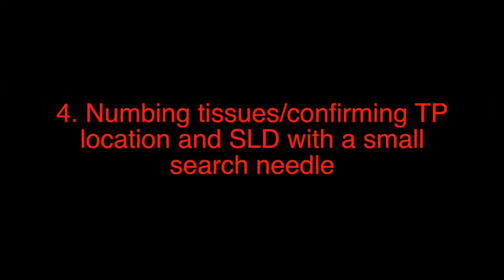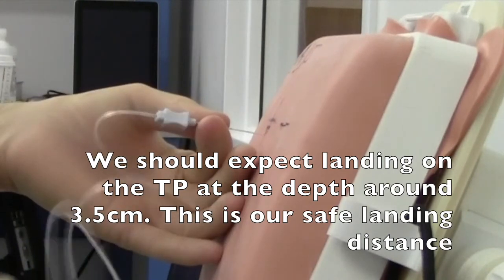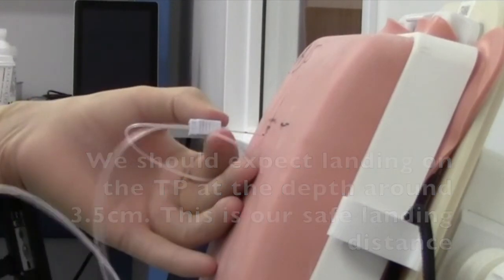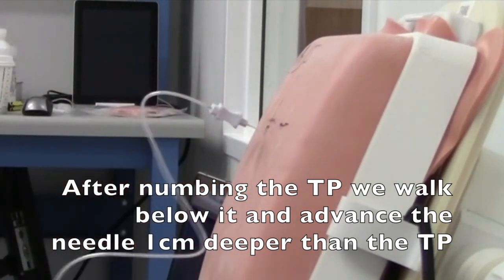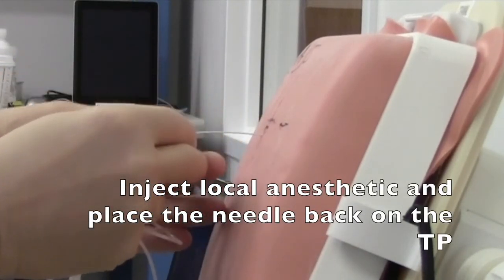Step 4: Numbing tissues and confirming TP location and SLD with a small search needle. We should expect landing on the TP at a depth of around 3.5 centimeters — this is our safe landing distance. After numbing the TP, we walk below it and advance the needle 1 centimeter deeper than the TP, then inject local anesthetic and place the needle back on the TP.